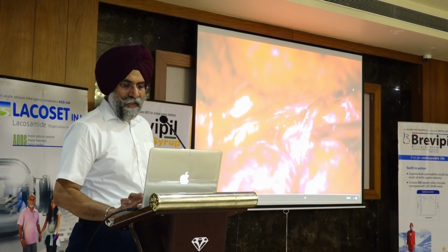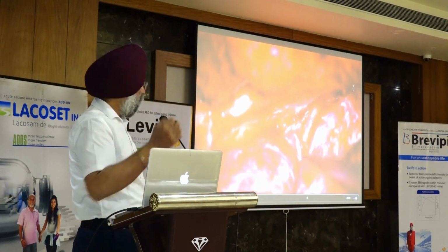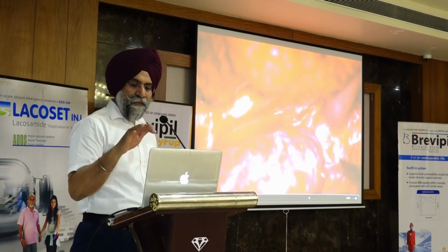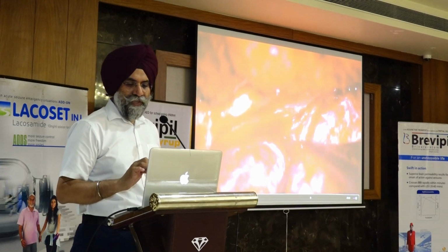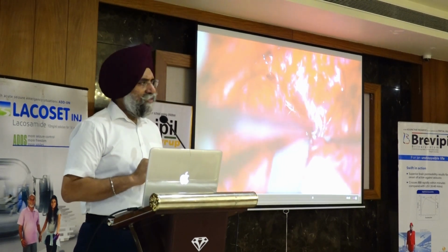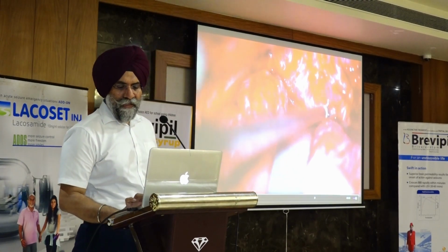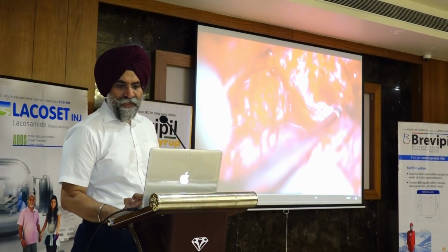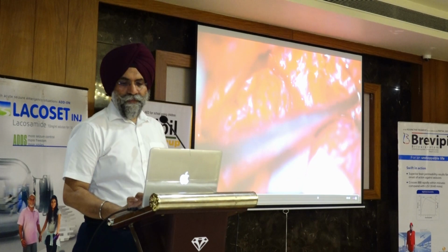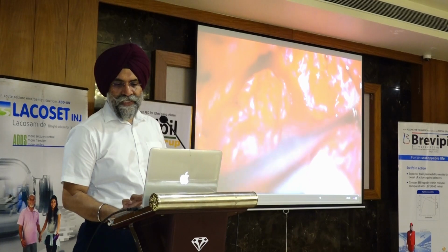Once your dissection is going on over the V3, you will always see that a little bit of CSF starts coming out from there, because there are CSF crevices from the Gasserian ganglion, which is very prominent over the V3 division of the fifth nerve. Usually venous bleeding is there, but it is not very challenging. If you remain in the correct plane, now you see that these are all the V3, V1 divisions, the nerve rootlets, going medially. This is the lateral, this is the medial part. I will show you later that in this area the third nerve is stretched over the tumor.